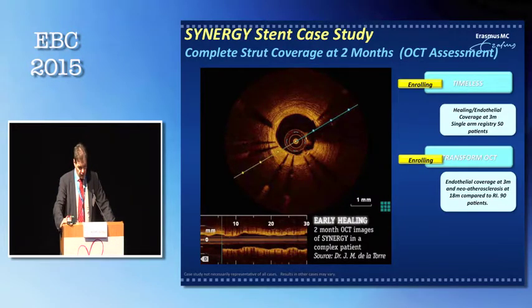That's what we have in there. This is an example. I used this one not from our patient group. If we can start the video. This was the first of the study done by Dr. De La Torre. This is an example of the synergy with this abluminal coating. And you can see this already only 2 months and see how fast it is covered.